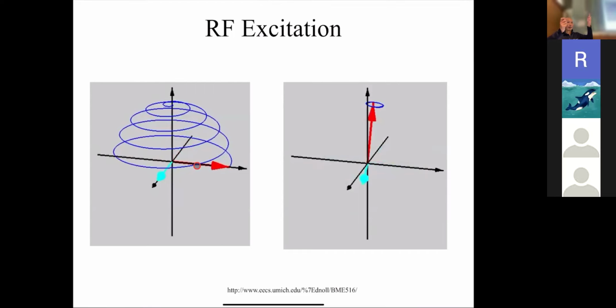If I had a coil over here, there's no change in the magnetic field here, right? But if I flip this down and I make it precess, it's really obvious that it's moving around, right? Similarly, this is creating a huge changing magnetic field in this coil, okay? So that's why we want this precession to be tipped away. So then we have a signal we can detect, okay?